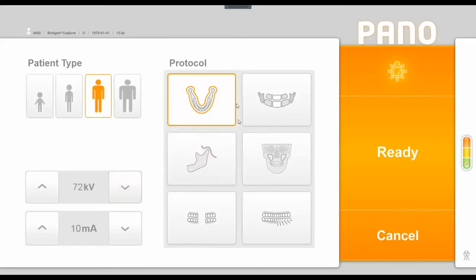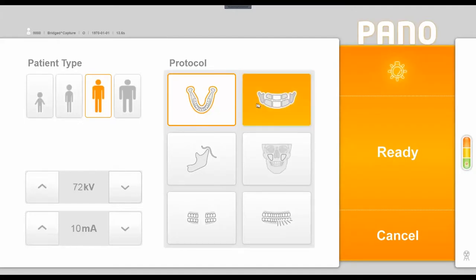The middle section of this window is our protocol options. This window will default to the standard panoramic image option, which we see here, and it will take your typical panoramic image.